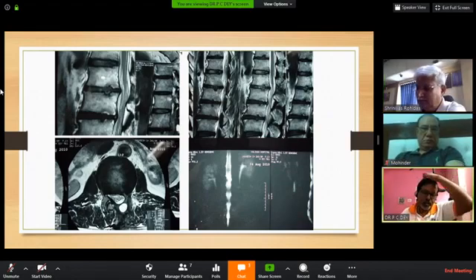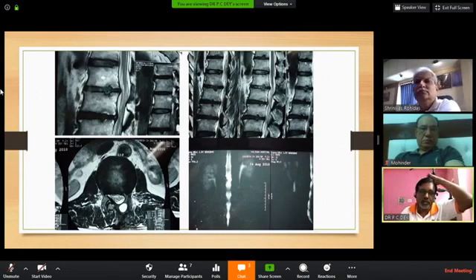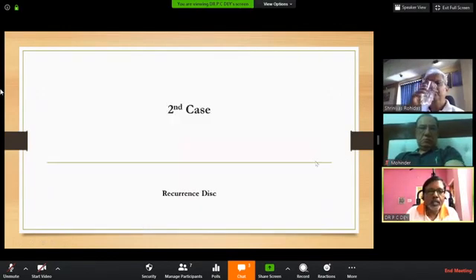Yes. So you saw the video, and I don't know where it is injured. But anyway, the patient is walking, you saw after 15 days, and I have done the MRI. It is not available here. It is about 3 months. They totally vanished, that dural injury or something. It heals. I will discuss later how it heals. Now come to the second case.